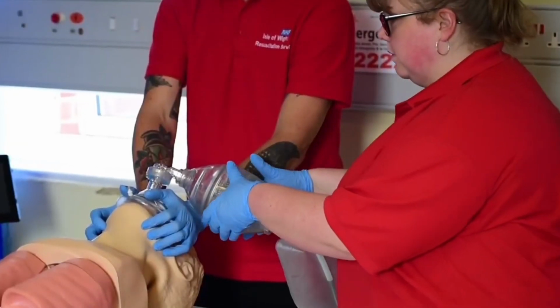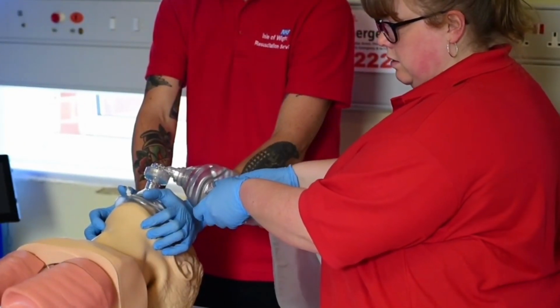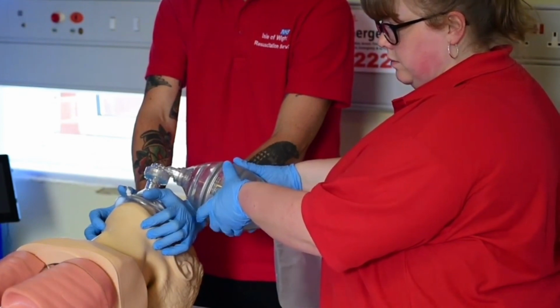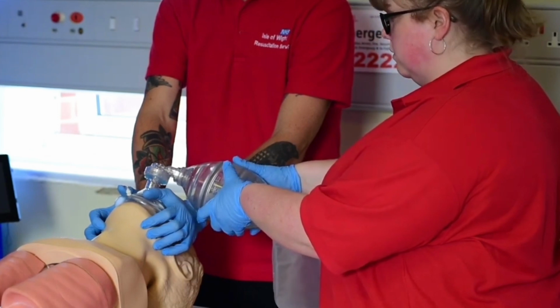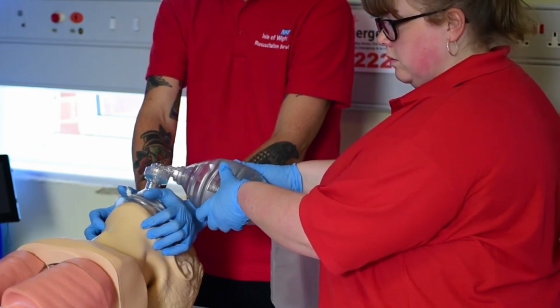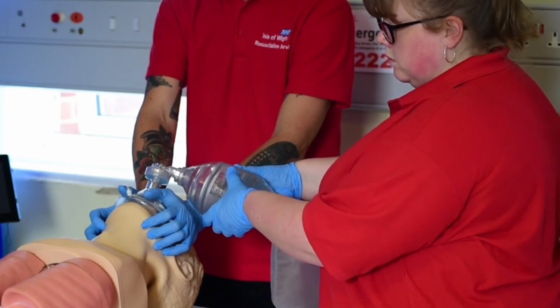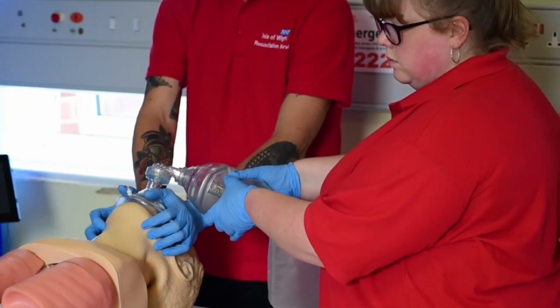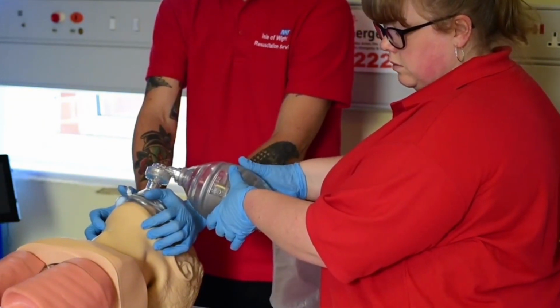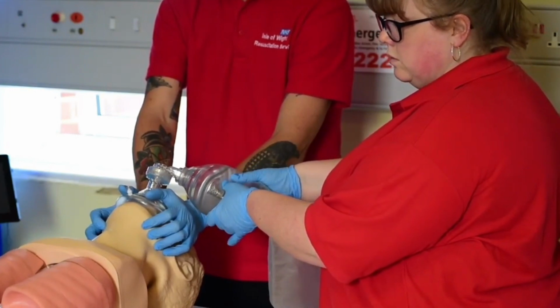A two-person technique is used by all non-expert practitioners, one rescuer holding the mask, the other squeezing the bag. The rescuer holding the mask should locate themselves at the patient's head or as close as possible to it. Consider moving mobile beds away from the wall and removing a headboard if possible, or moving the patient safely and with assistance if required.